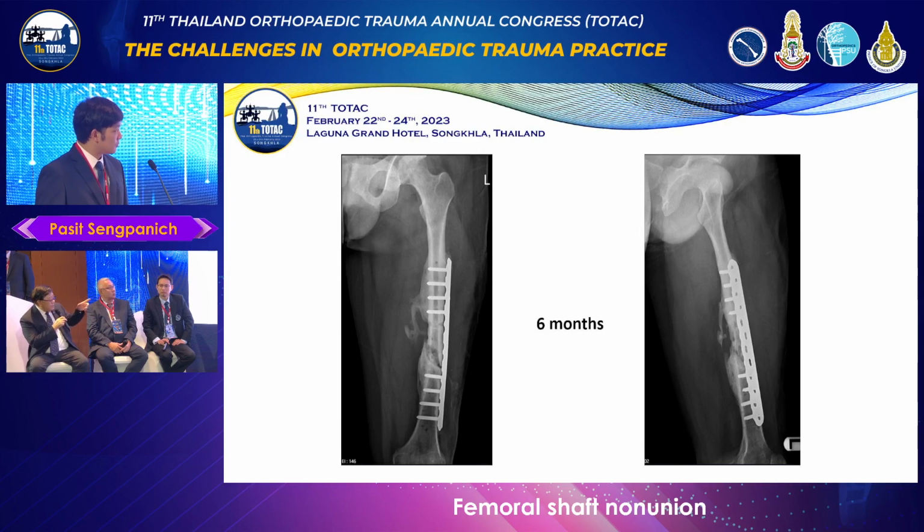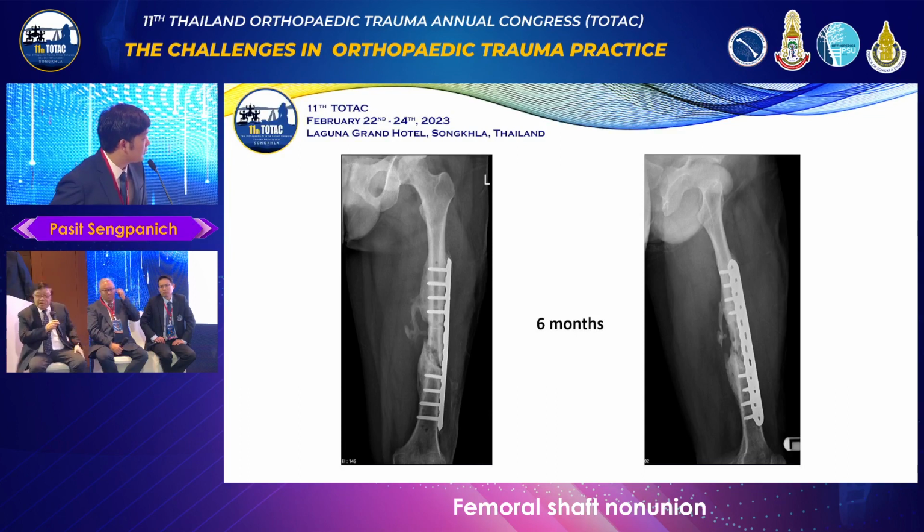Now, the point is that because the span is too much, because we are concerned, right? But this is not a simple fracture, you may say. That means you can put screws even a bit closer. I still wonder whether the length of the plate is enough because this is a bridging. When I try to count the number of holes and the plate, I'm not sure. But if you put more screws on the top, probably it increases stability.